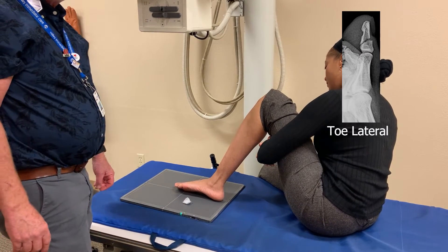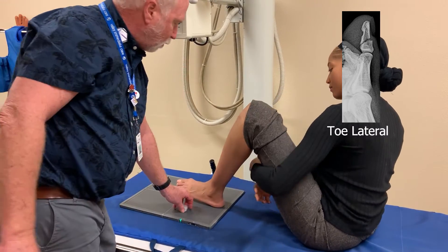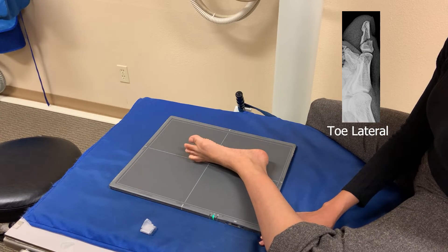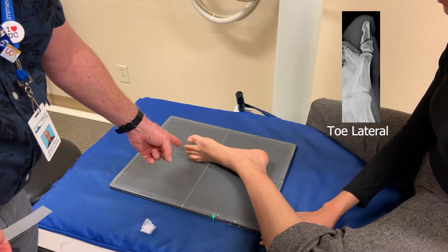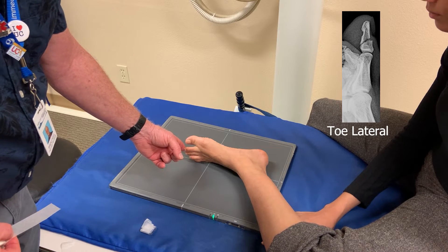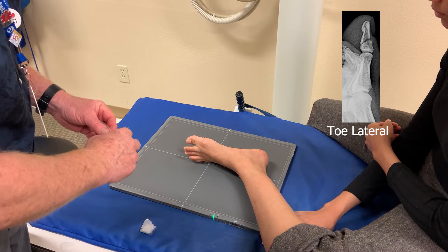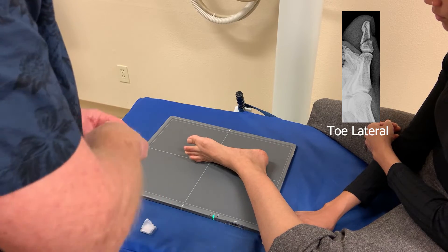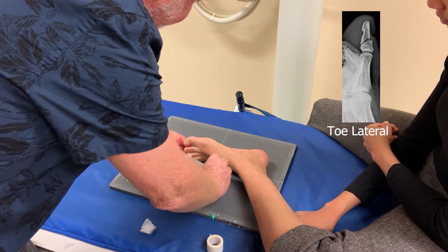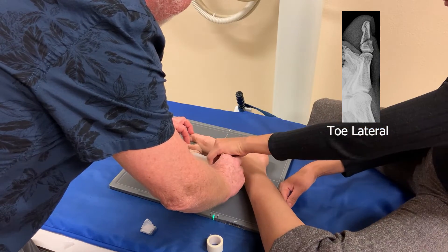The lateral is where it becomes pretty difficult. Being other than a little toe or a great toe, we're going to roll her laterally, and then we want to separate those toes. What I see a lot of people doing is tugging on the affected toe. If she just broke this toe, she's not going to be real happy if you're tugging on that toe. So the drill is, you move the other toes out of the way. Looks like she's got a great toe out of the way pretty well. I think we may be able to pull her other toes kind of forward — I'm going to catch those toes right here. Roll up just a little bit more. Can you hold on to that, Nikki? Kind of pull those toes back.